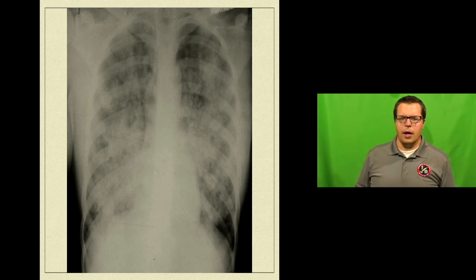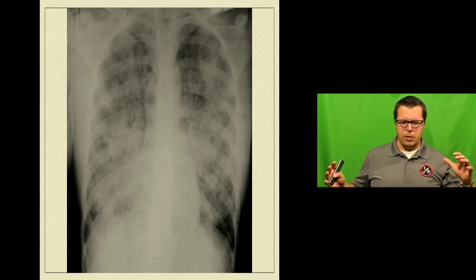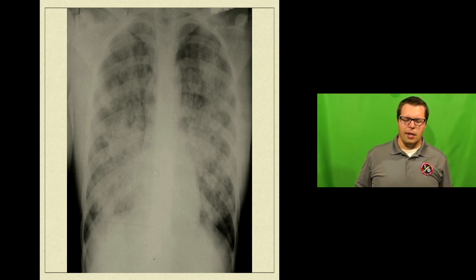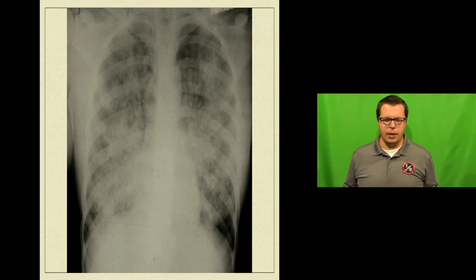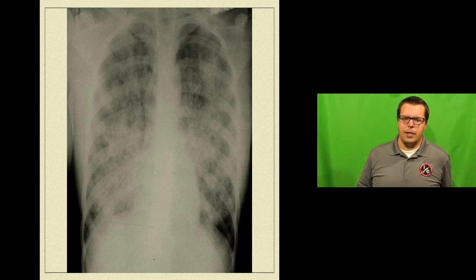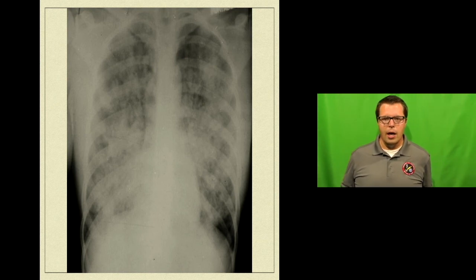What initially we kind of thought with mechanical ventilation was that if you put somebody on mechanical ventilation, you give them big breaths because that makes their blood gases better, and everything looks better from a parameter standpoint if you give them big tidal volumes. So we were giving breaths at like 15 milliliters per kilogram of body weight with each breath. So you're talking about a liter, a liter and a half volume with each breath. And you find that anybody that's on a ventilator for any length of time with that, even the course of a day or a couple of days, starts to develop ARDS, starts to develop lung injury as a result of it.